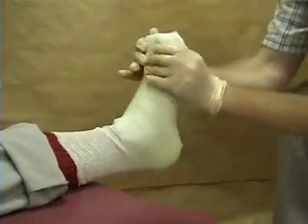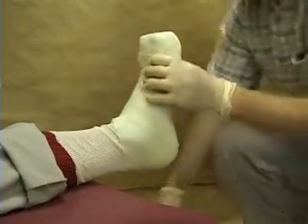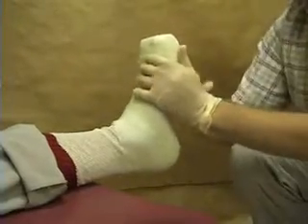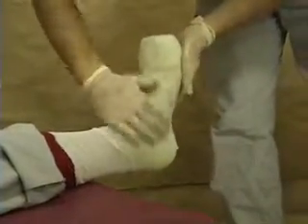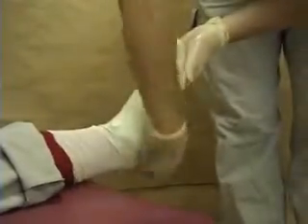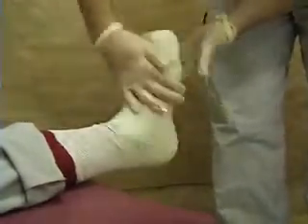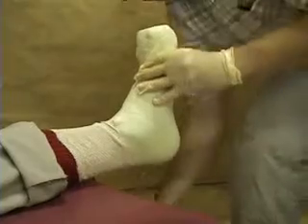Feel this starting to get a bit warm here. To speed up the process of the setting of the material, we can add some water in the form of some lotion, and it's really just being used because of its water content. It makes it easy to rub in. There are various wrapping methods that can be used in order to make a boot like this, and you might want to check the boots that have been made to see different samples. They've all got advantages and disadvantages.